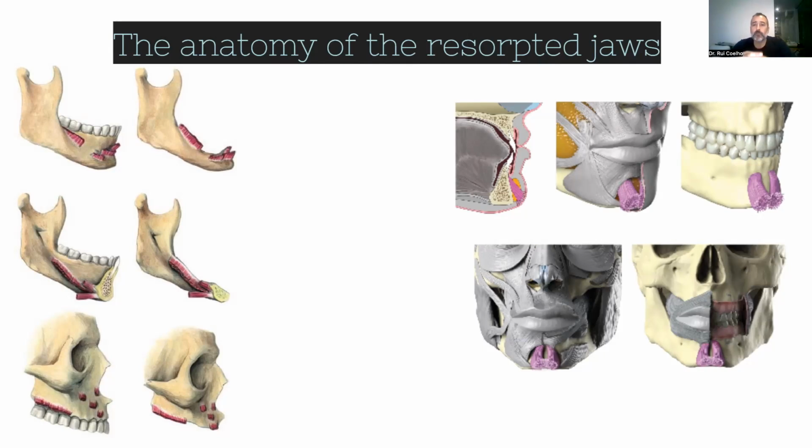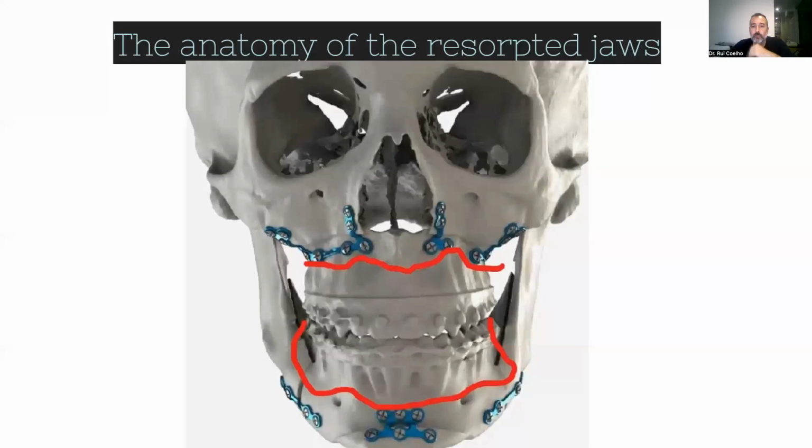So with this thought, we have looked to our experience on plating, mainly on orthognathics. And we know that on orthognathics, we have places to put our plates. Otherwise, they will be exposed. And one of the most commonly exposed is the one from the zygoma. It's really exposed over time. And sometimes we even have to remove it. And what have we found when we remove it?